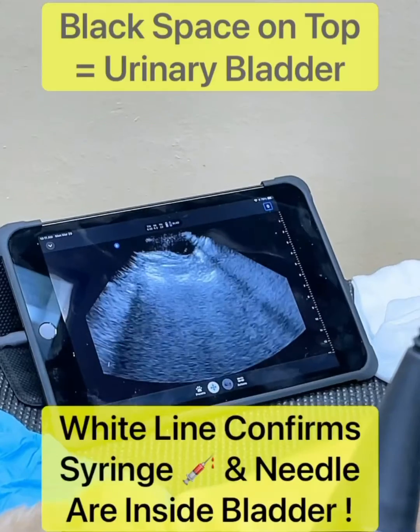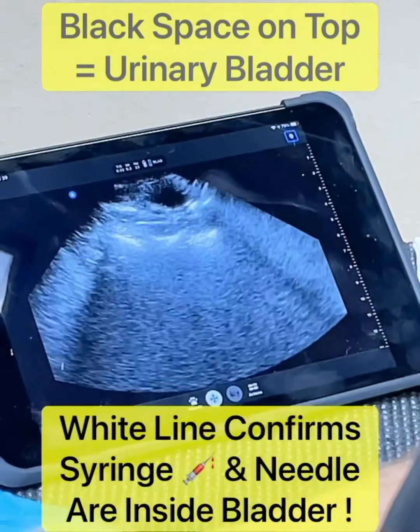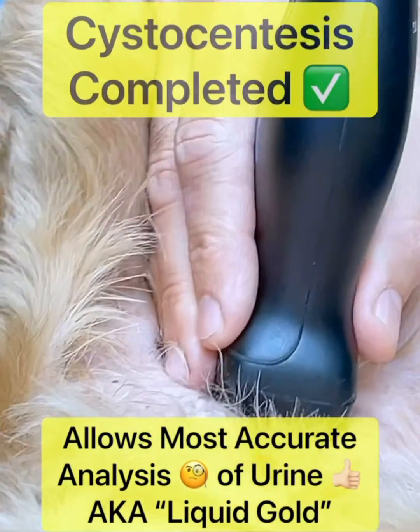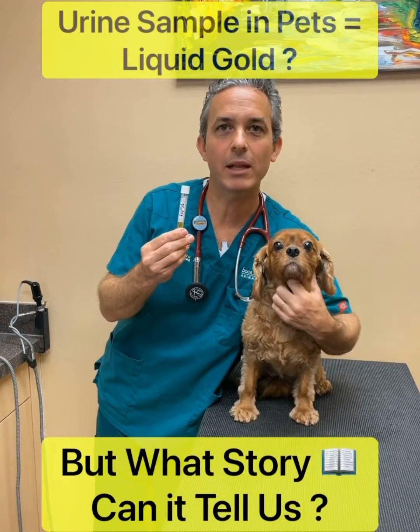You can see the needle that's in the bladder — you can see the white part moving — and now you can see in the syringe I have my urine sample. Here in my hand is the urine sample directly from Ruby's bladder.